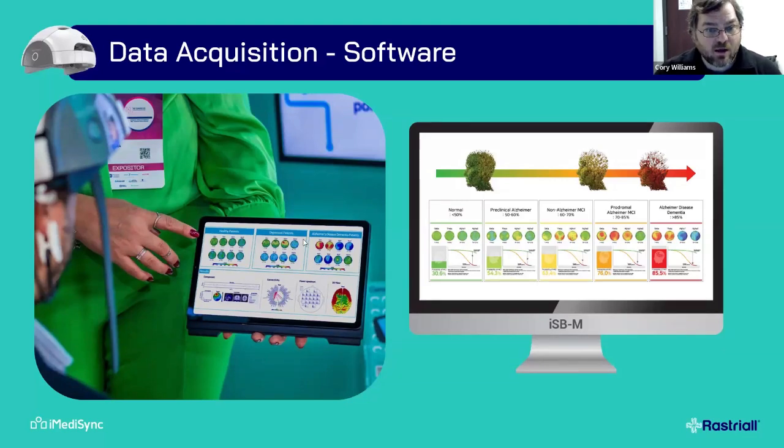And you can see on the left-hand side, we get a look at what different conditions might look like, healthy versus depressed versus Alzheimer's. On the right-hand side, you can see what happens when we run an individual's data set through some sort of discriminant function. So this is useful for clients who are aging. There's a discriminant function for head injuries. There's one for learning difficulties. So there's a lot of different tools that you can use to inform a client about what their brain function means for them.